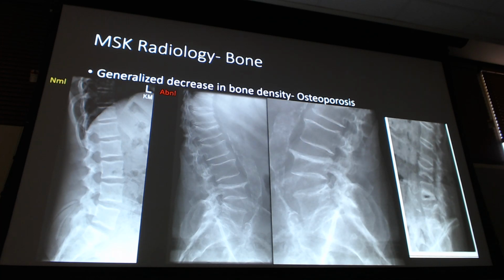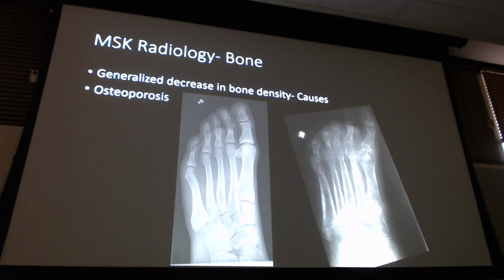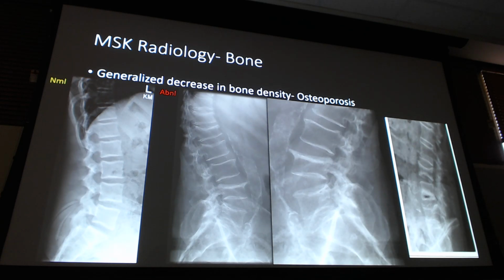Okay? Yeah. With the foot versus the spine, the foot is like below weight versus the spine, which is. Someone down here? Yeah. No, up higher. Here? Like the actual metatarsals, they all look pretty bright versus the spine, which is very radiolucent. Good question, right? Like, why is that? Good question. So, what's that? And more tissue? More tissue, and he's exactly right.